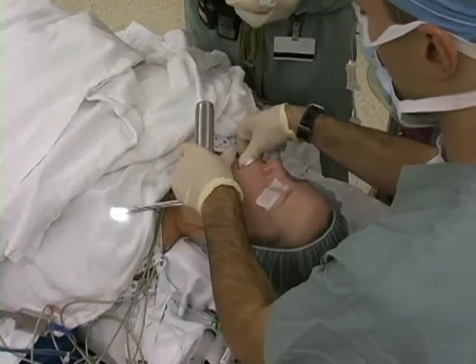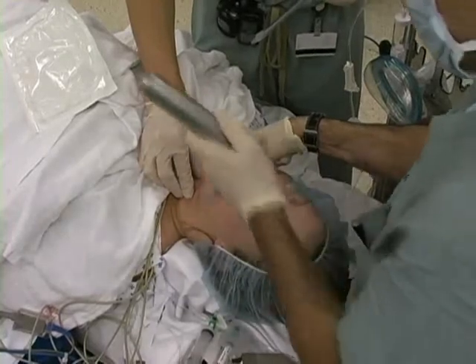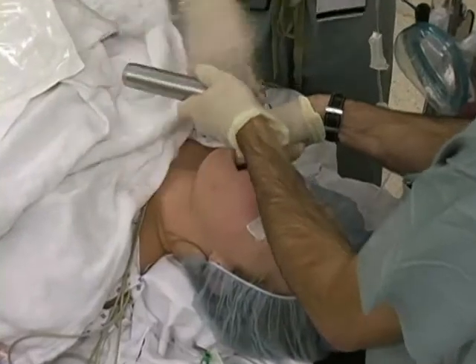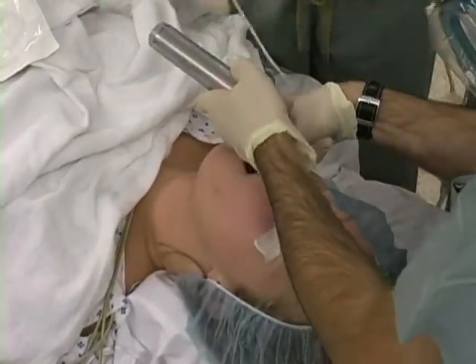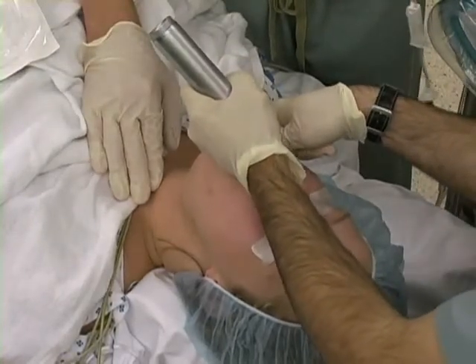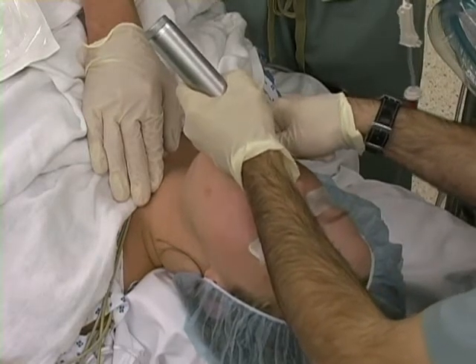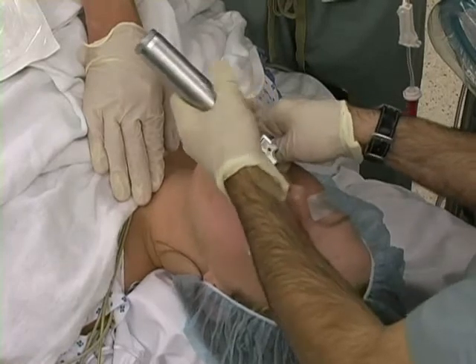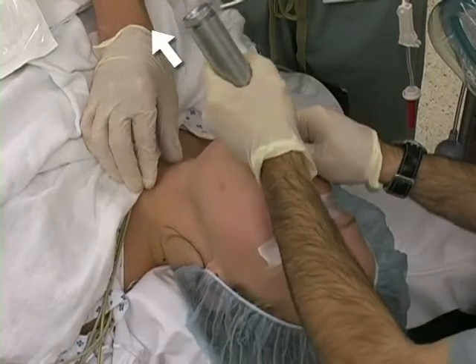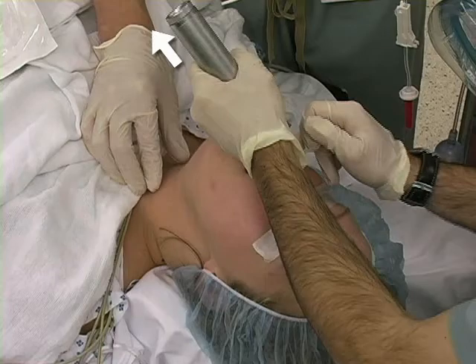Stand at the head of the bed and scissor open the oral aperture with your right hand. Grip the distal part of the blade handle in your left hand. Insert the blade into the right side of the patient's mouth. In contrast to the Macintosh blade, displace the tongue to the left while keeping the blade itself slightly to the right of midline. When the epiglottis is visualized, advance the tip of the blade under the epiglottis. Lift the blade handle, moving the epiglottis and soft tissue out of your plane of view. Visualize the glottic opening.